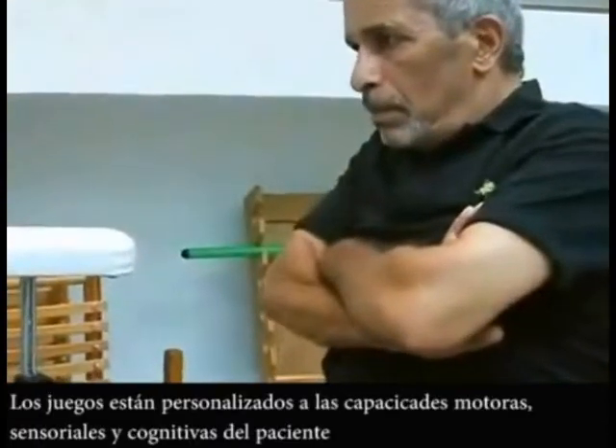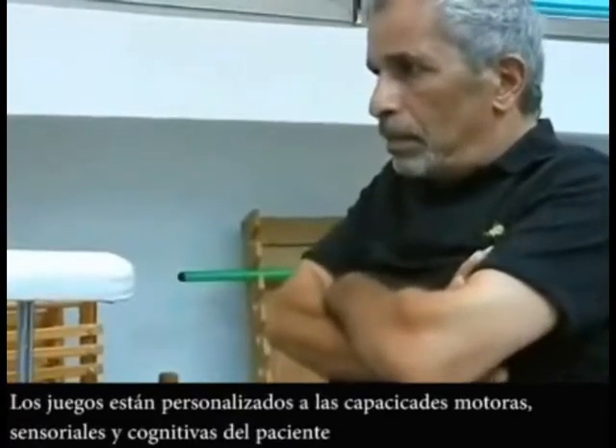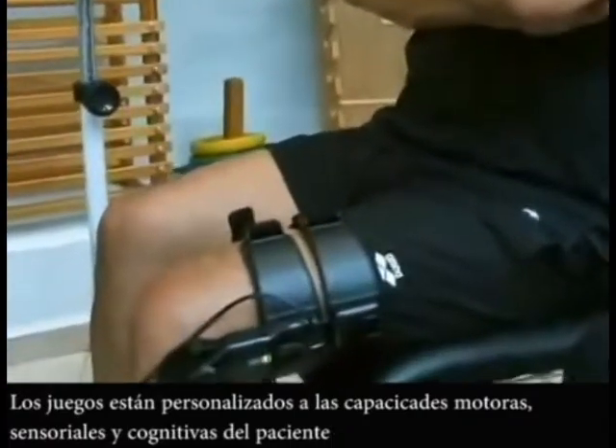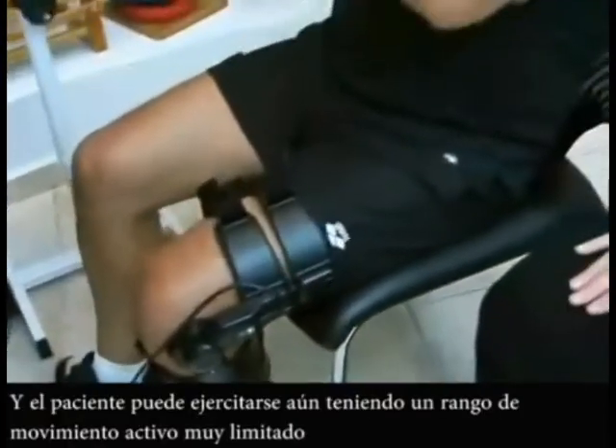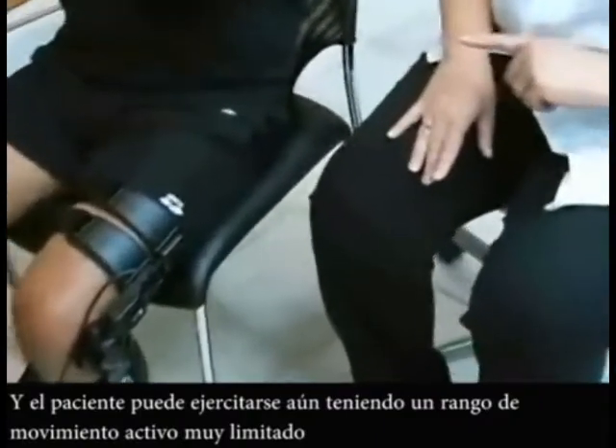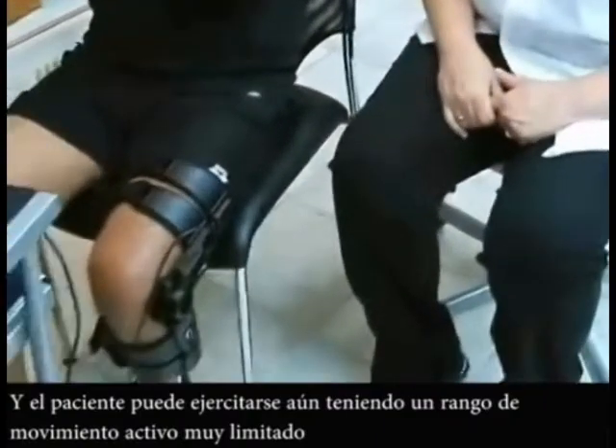The games are customized to the patient's motor, sensory and cognitive movement ability, and the patient has the possibility to start exercising even with very limited active range of motion.